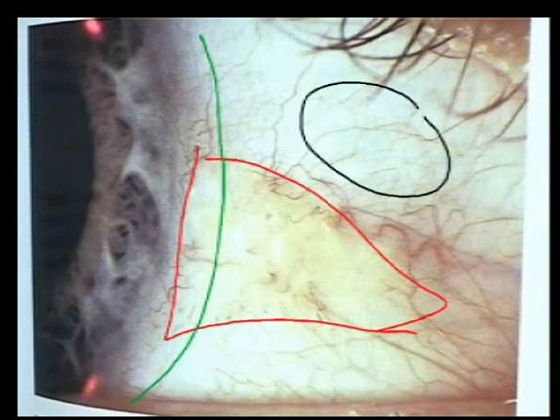And over a period of time, it will get a little more elevated, a little bit more discolored. And sometimes a contact lens, if you think the green line is the edge of a soft lens, for example, depending how the lens is fitting, it could cause some irritation to that area. So that's something, and it may affect the fit of the lens depending on how elevated it is. So that's something that we would pay attention to.